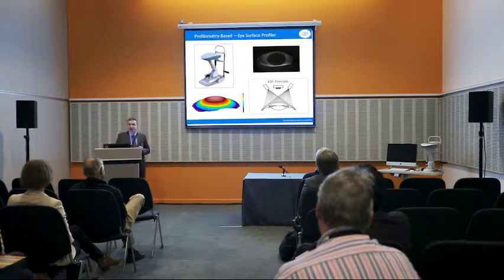So what it can do is work out and separate those distortions so that it overcomes some of the basic limitations of Placido-Disc-based systems, and in so doing is a little bit better with more irregular corneas. However, you are still limited to the fact that it's a specular reflection device and therefore can only image up to the limbus. So that brings us to the ESP.